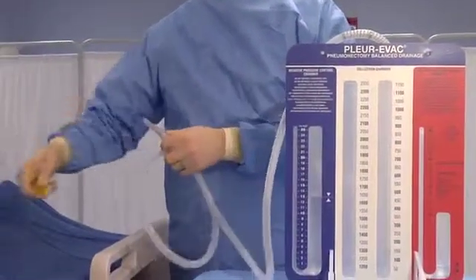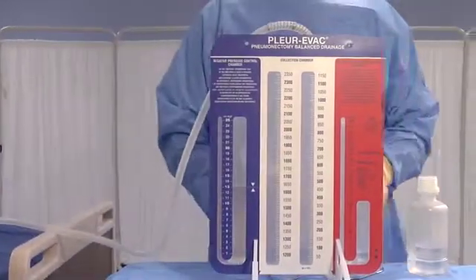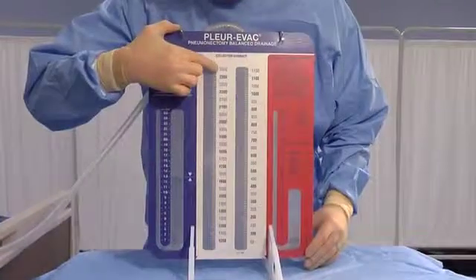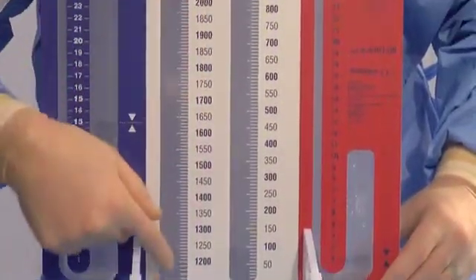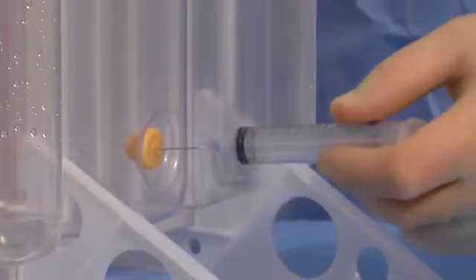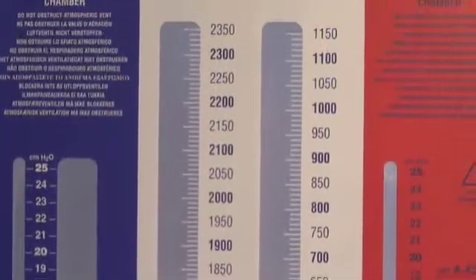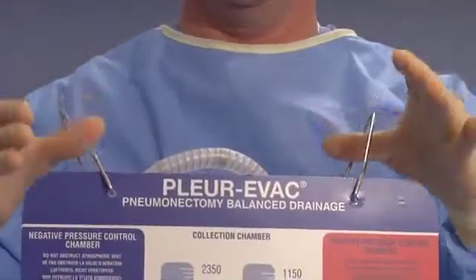Remove and discard the protective cap on the Plurivac patient tube connector. Connect the patient drainage tube to the patient's thoracic catheter. The patient collection chamber has a total capacity of 2,350 cc and is divided into two compartments, each calibrated in 10 cc increments. A self-sealing diaphragm is provided in the back of the collection chamber; use an 18-gauge needle or smaller attached to a syringe for withdrawing samples. Marking surfaces are provided on the front of the unit — use pencil or pen. There are two metal hangers to facilitate transport. Replace the unit if or when it fills to capacity.